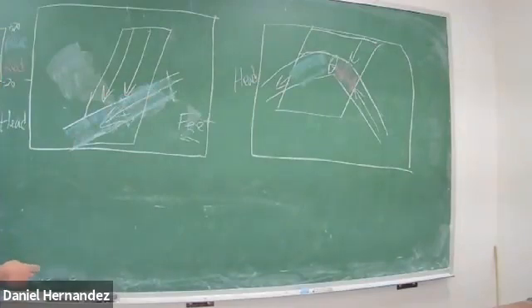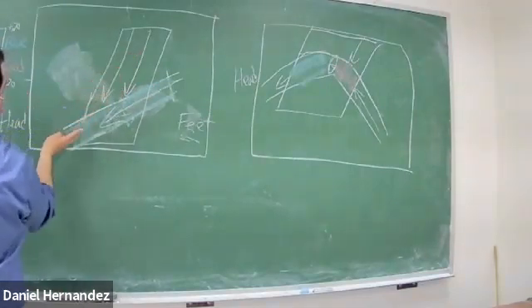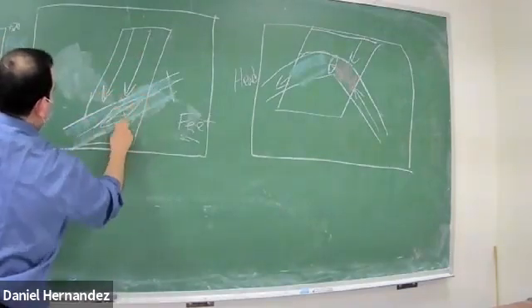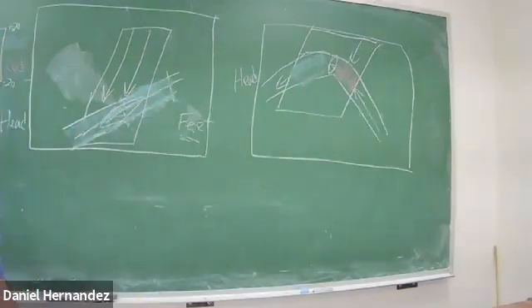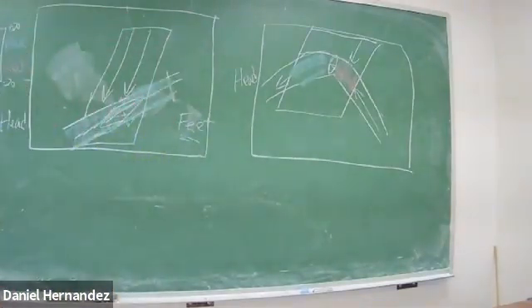Because I'm now looking at my Doppler shift color bar over here and I'm seeing that a positive Doppler shift is blue. So that means that blood flow going towards my ultrasound beam has to be blue. So that means that blood flow is now reversed and headed back in the other direction, up towards my ultrasound beam. So you have to look at your color within the vessel, look at the angle of your box and the direction of your beam, and put all those three pieces together to figure out your flow direction.